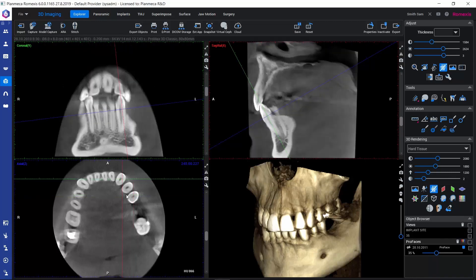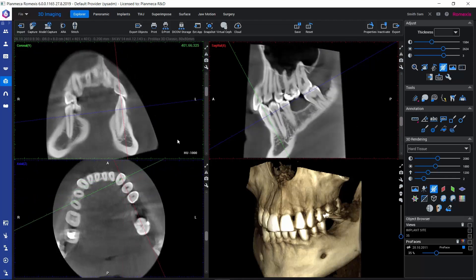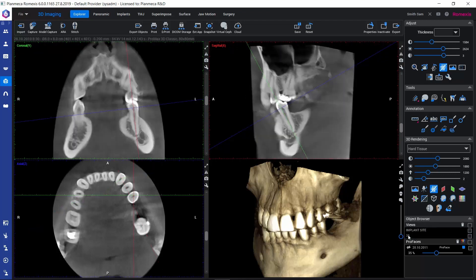Then we can go on, navigate in the volume, and look for other findings. Now, if we would like to go back to that view where we were earlier, we can find our view here in the object browser under Views. We can click on the name of the view that we saved and Romexis will take us back to the view we had saved earlier.